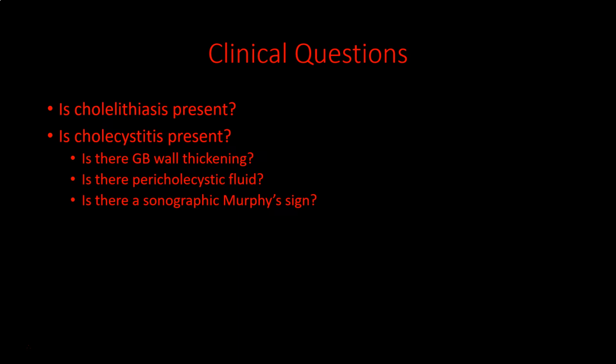But basically, as a reminder, any point of care ultrasound study should be binary. Yes, no questions as much as possible, with little room for subtlety. The rationale there being that if you have any confusion or any concerns, a definitive diagnostic test is helpful. But if you're seeing this patient in the outpatient office with severe right upper quadrant pain and you're going to try to get them scheduled for an ultrasound, which might happen next week, diagnosing them with cholelithiasis or potentially saying, hey, I'm worried about cholecystitis early, is a good thing to do.